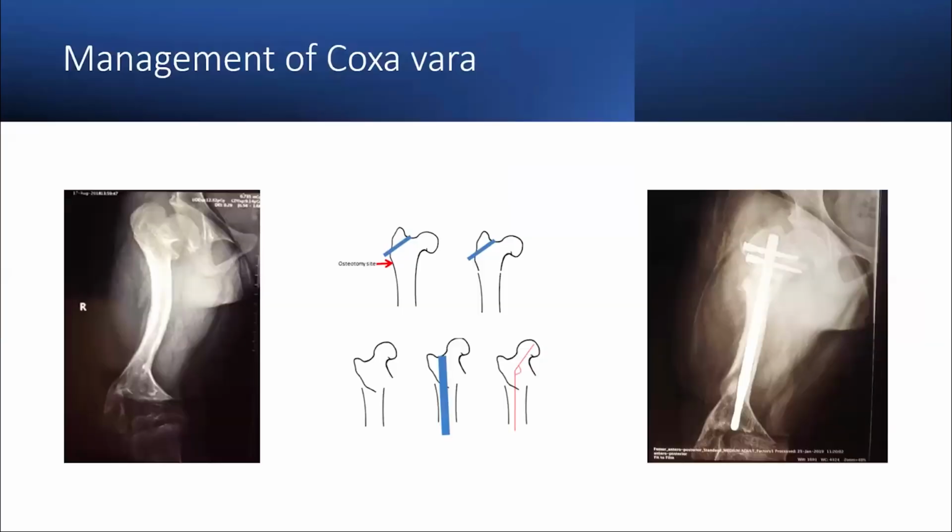And I'm just going to conclude with a few sample cases. So this is a patient who has coxa vara, for example. This procedure would be carried out using a standard open lateral approach to the hip. You create a track for the nail, which would be the blue line there, and then identify the osteotomy location under direct vision, complete your bone section, reduce the distal fragment in relation to the proximal fragment, and then introduce your implant.